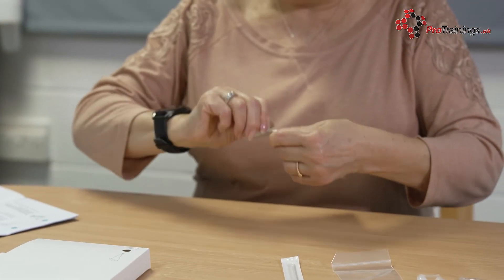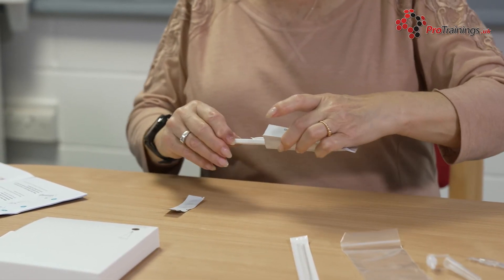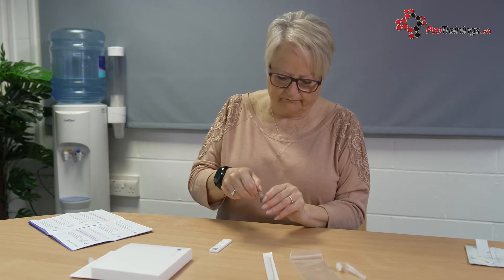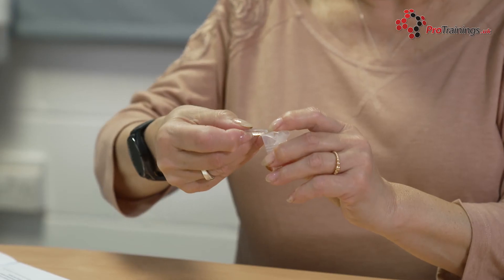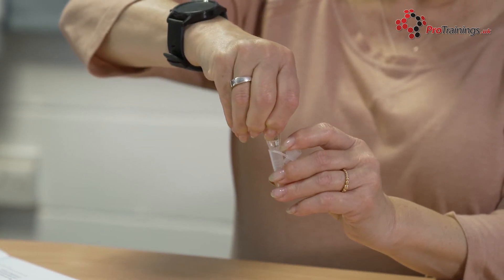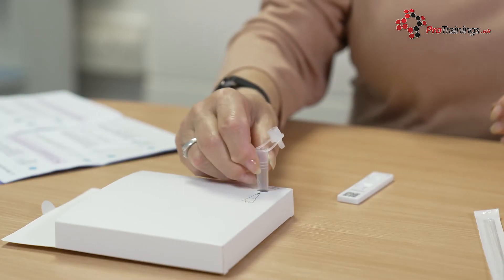Set up for the test by taking the test strip out of the packaging and placing it on a clean flat surface. Once opened, the test must be used within 30 minutes. Carefully twist or snap open the sachet, but be careful not to spill the fluid or splash it in your face. Open the extraction tube and gently squeeze all of the liquid from the sachet into the tube. Place the filled tube in the extraction tube holder to avoid spilling the liquid.